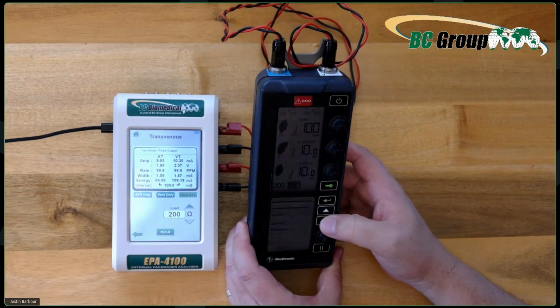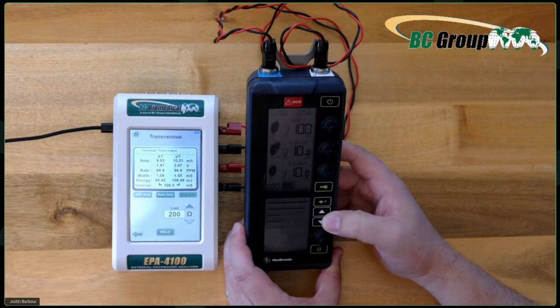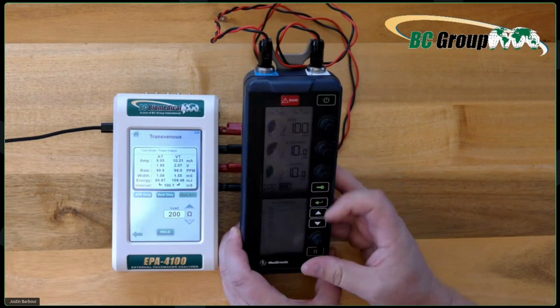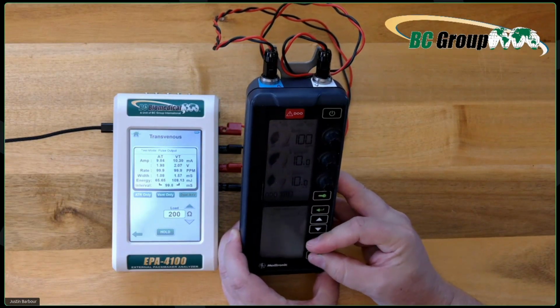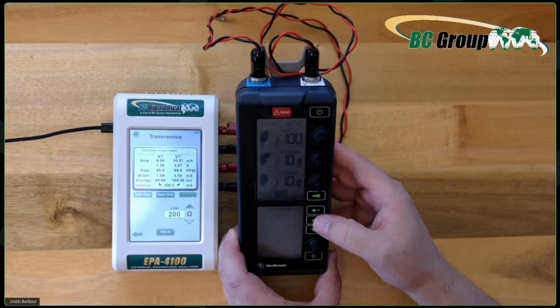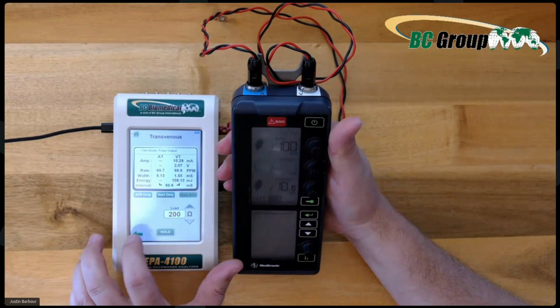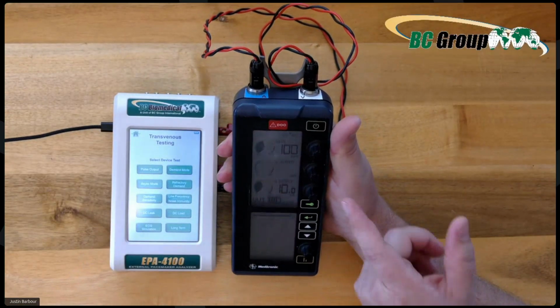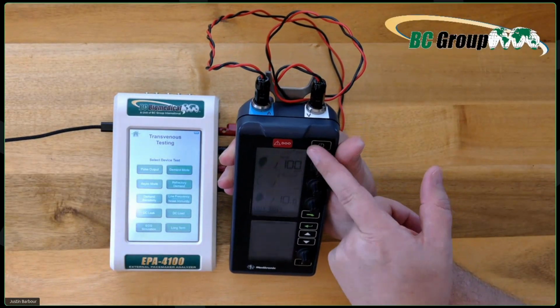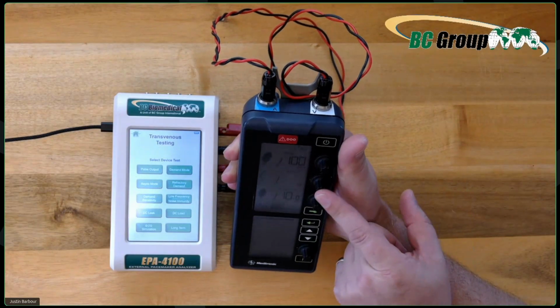And let's go ahead and change the modes so you guys can see some of the other things that are going on. Let's go to VVI. When you test something like VVI, notice how it's only going to the ventricle, and notice also that atrial is disabled.